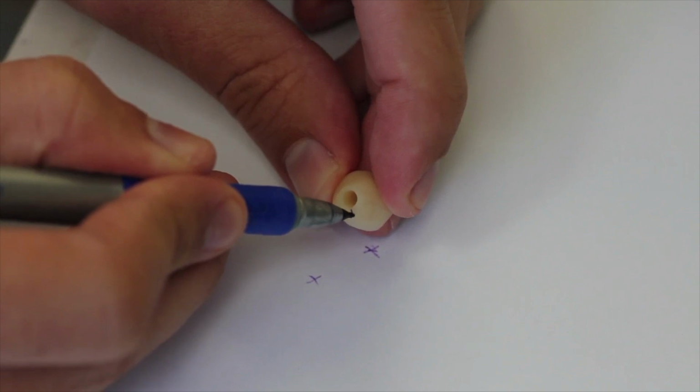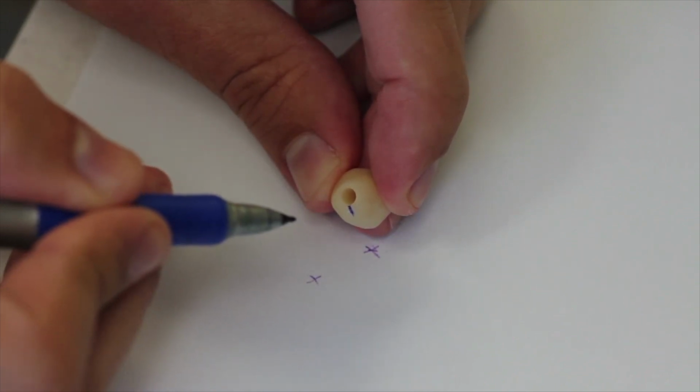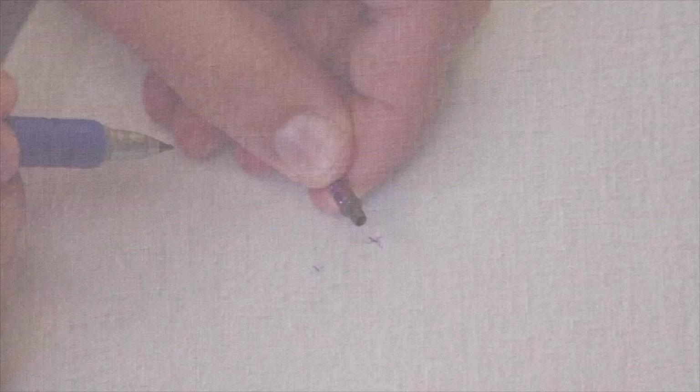Using a waterproof marker, mark the female connection of the precision attachment on the Emax abutment and the male notch of the titanium base on the implant analog.